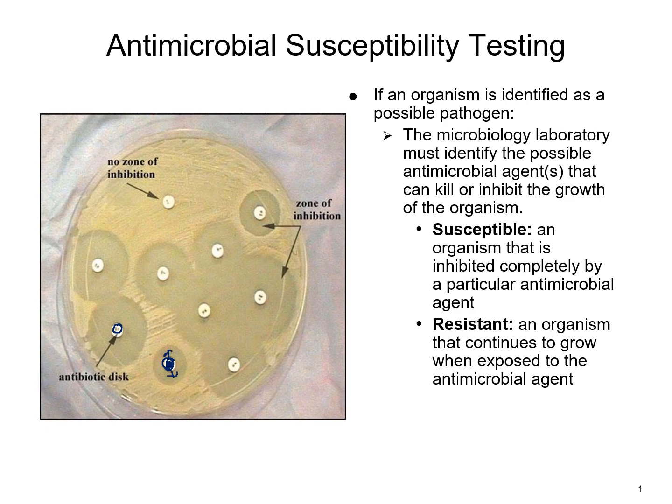And as it leaches out, the closer it is to that disc, the more concentrated it is, and the further away from that disc, the weaker the antibiotic gets as it leaches out. So when you're looking at these, you would take a ruler and usually look at the back of the plate, and you're measuring the distance across the center. You'd get a special ruler out and do that measurement, and then you'll determine, based on that value, whether it's considered susceptible or resistant.